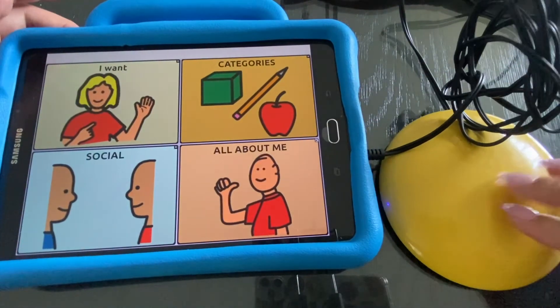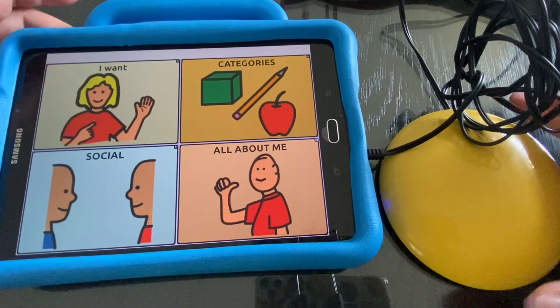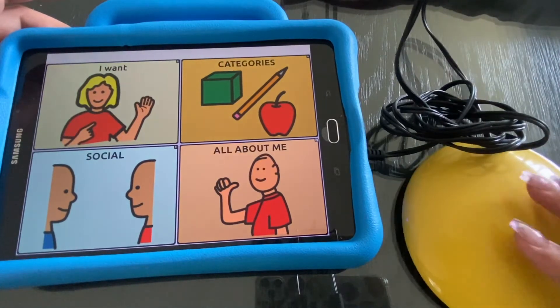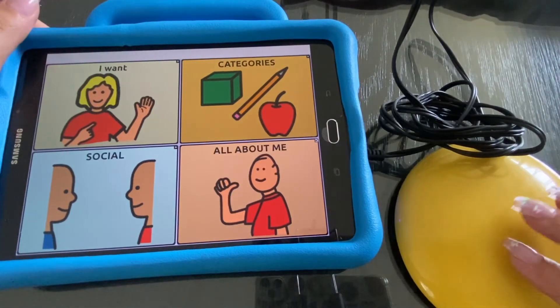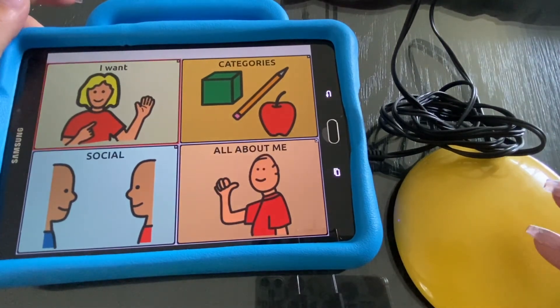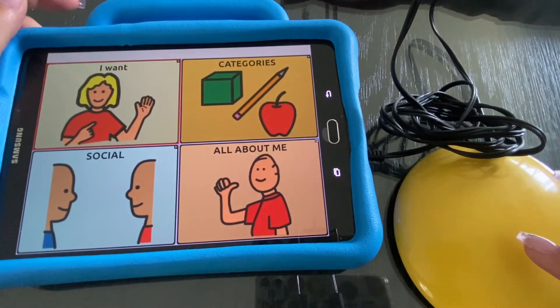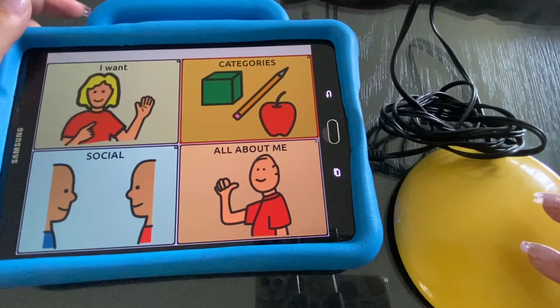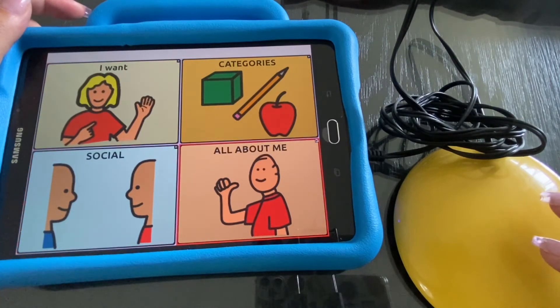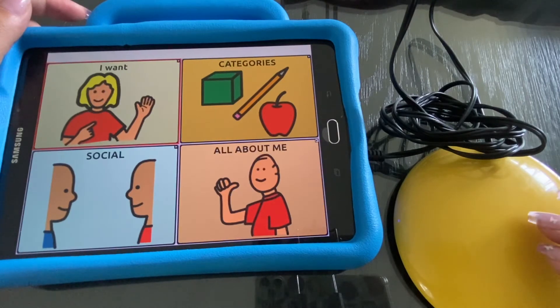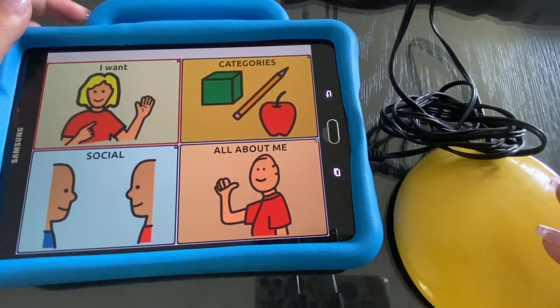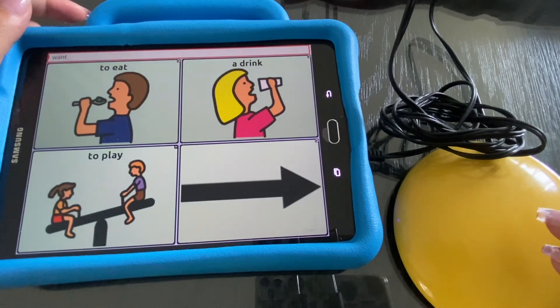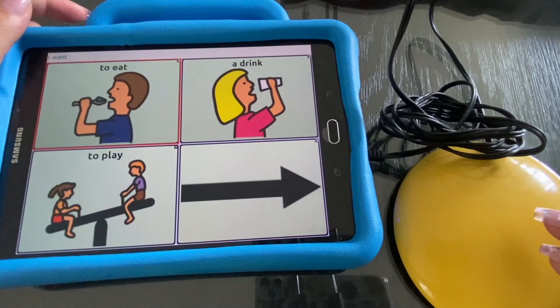Push the button to begin. I want categories, social. So that's the auditory prompt voice. All about me. I want. And that's our selection voice.